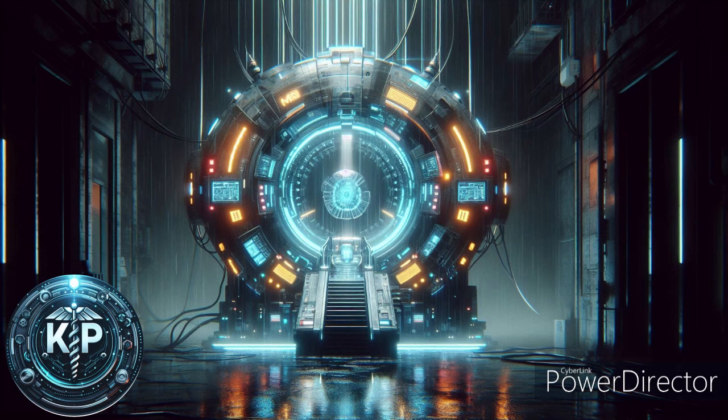Permanent magnet. Some MRI machines use permanent magnets made from magnetized ceramic bricks. These create a strong magnetic field necessary for the imaging process and are designed to be large enough to comfortably fit a patient. Iron frame. In systems with permanent magnets, the iron frame supports the weight of the magnet and helps focus and constrain the magnetic field to the desired area.